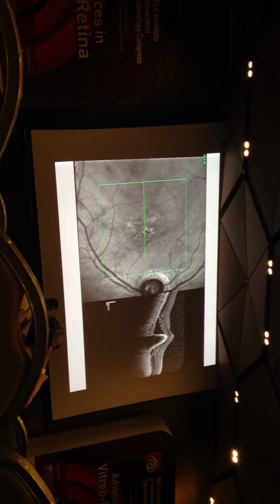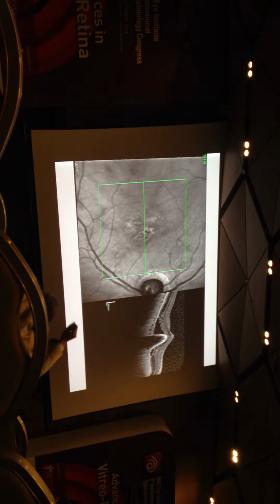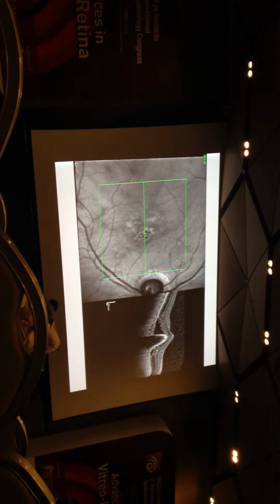One thing that you have to consider is that sometimes, not all the time, the RPE regrows. You remember the first rip, the fluorescence was very strong because it was leaking from the choriocapillaris. You were directly seeing a choriocapillaris effect.